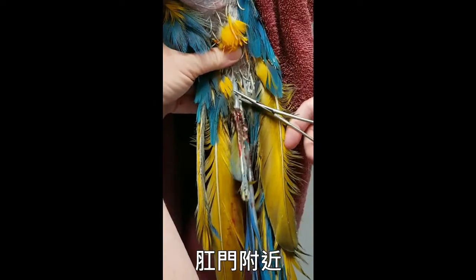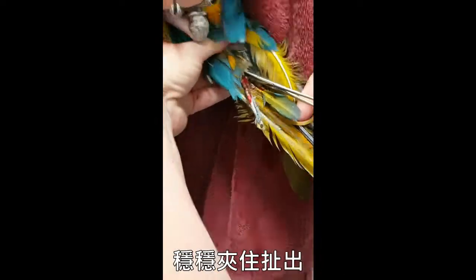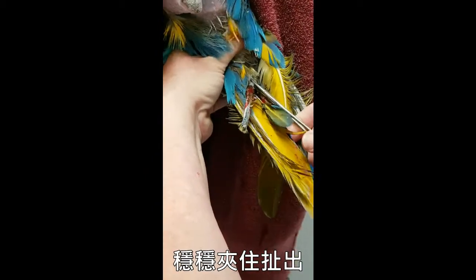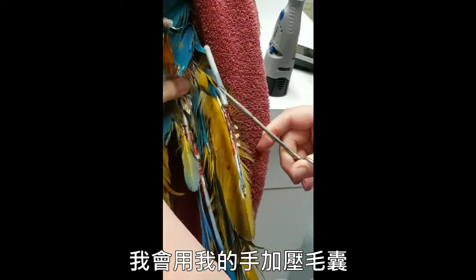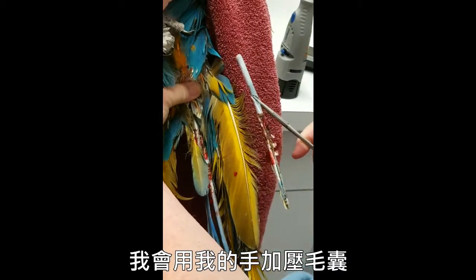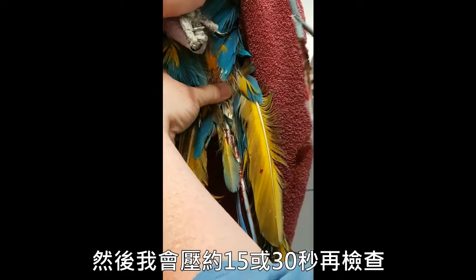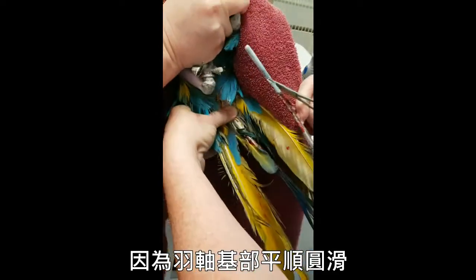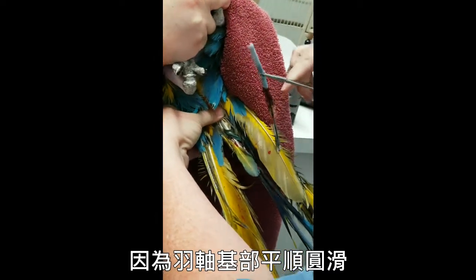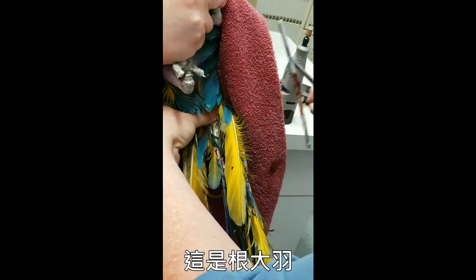It's going to hurt when I clamp down, so the bird's gonna scream. Clamp down firmly and pull. Then I'm going to use my fingers to apply pressure to the follicle and hold that for about 15 or 30 seconds, and then we'll check. We got the entire feather out because the end of the shaft is smooth.